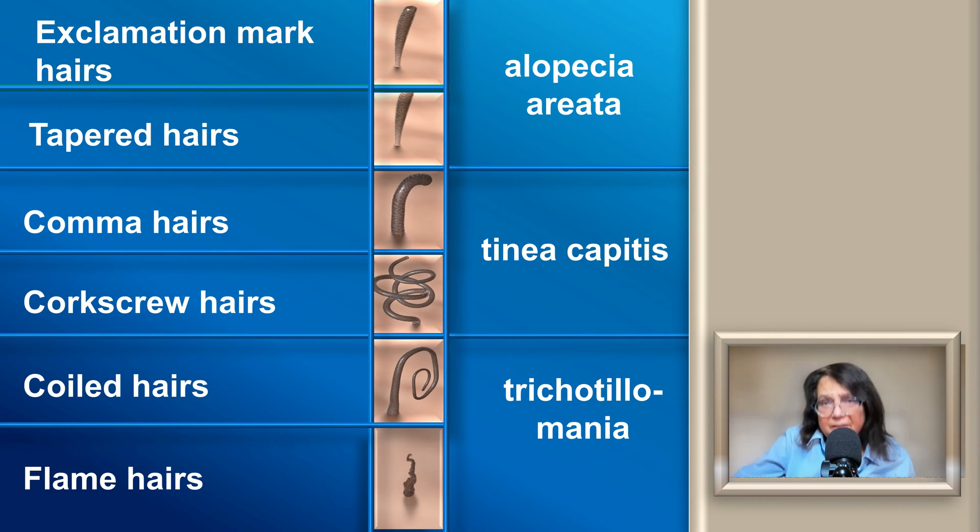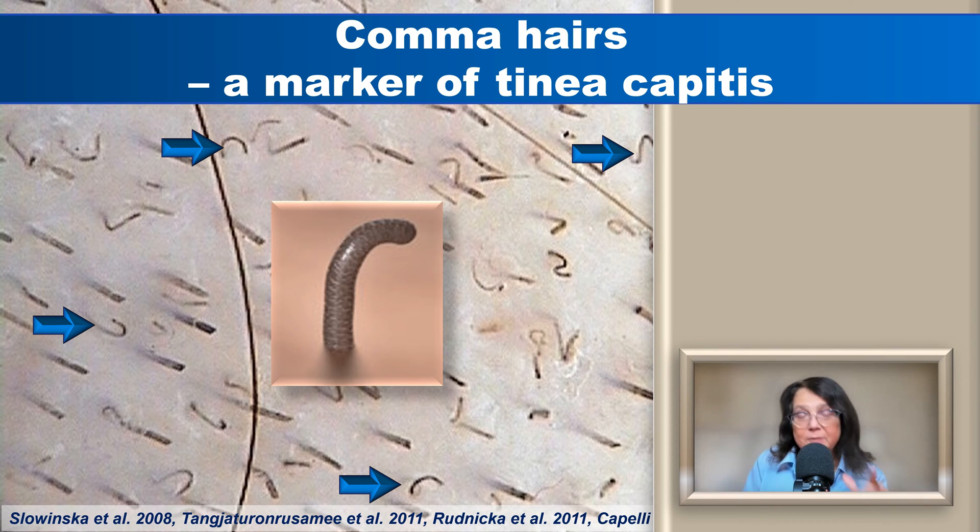There are several other hair shaft abnormalities that may serve as markers for certain diseases. In addition to exclamation mark hairs and tapered hairs in alopecia areata, in tinea capitis you will see comma hairs and corkscrew hairs, and in trichotillomania the most specific features are coiled hairs and flame hairs. Let me show you a few examples of how these look in trichoscopy.